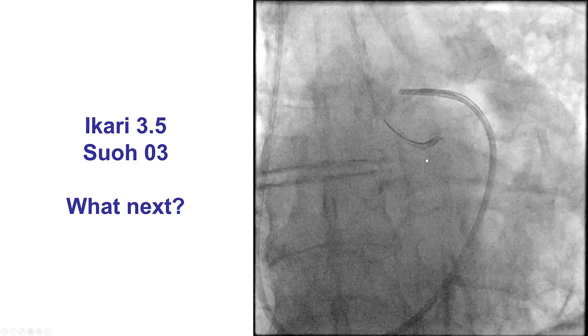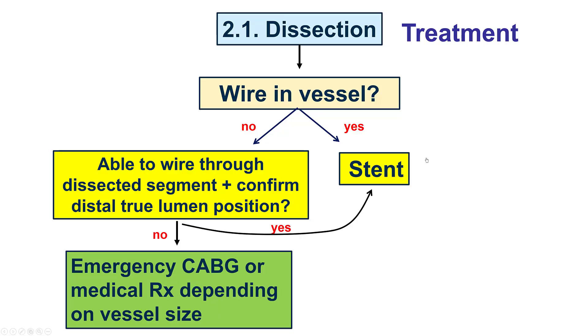So what is the next step? The presumed cause here is that we have caused a dissection in the left main, compromising the vessel. We are in the very tenuous situation of not having a guide wire in the dissected vessel — because if we cannot get a guide wire through and place a stent, which is the treatment for dissections, the patient might have to go for emergency bypass, especially given his known CTO of the circumflex.